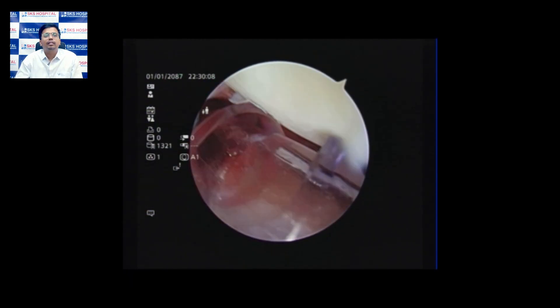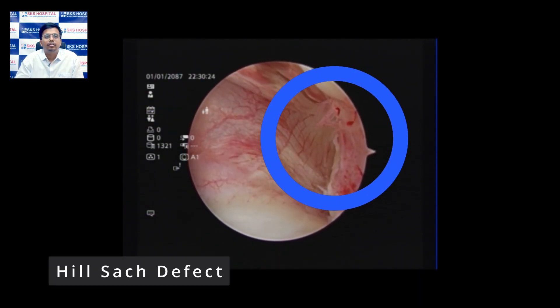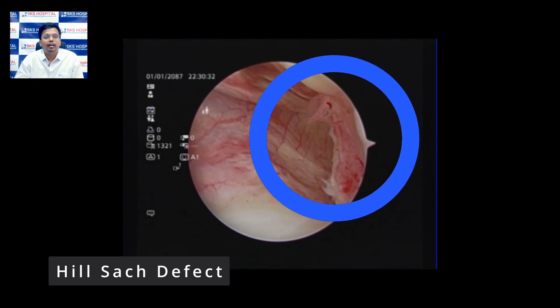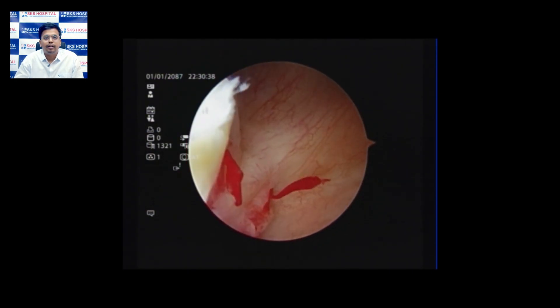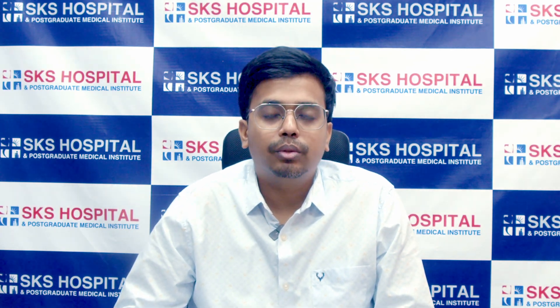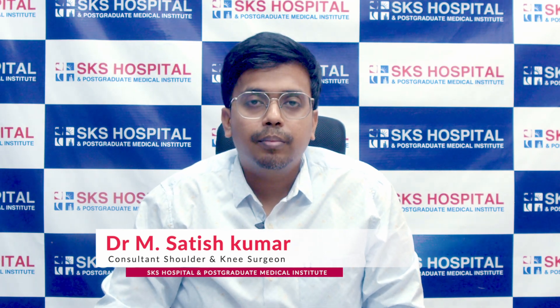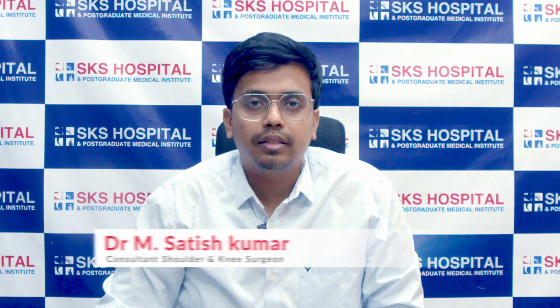With the portals established, we look for the Hill-Sachs defect — the defect on the posterior superior part of the humeral head. As you can see, highlighted by the blue circle, the Hill-Sachs defect is visible here. We also see the capsulolabral complex lying below the glenoid, detached and lying down. Our objective is to raise this labrum and fix it back to the glenoid, and also address the Hill-Sachs defect.